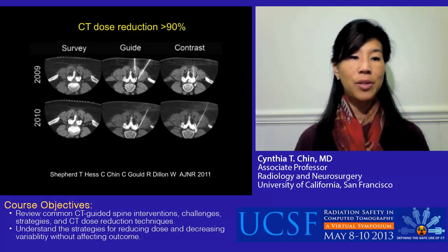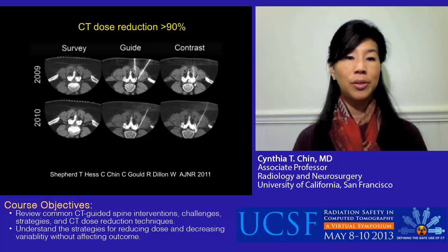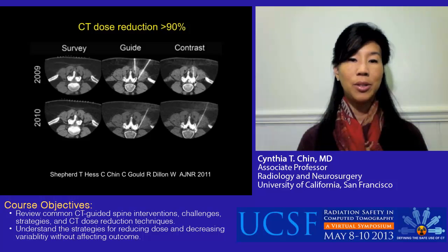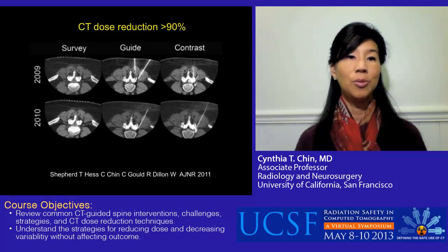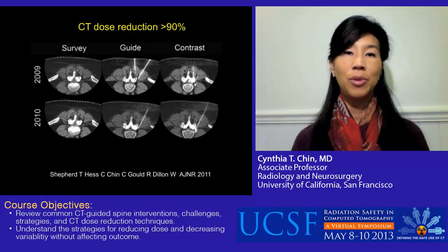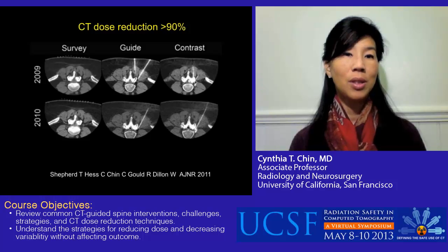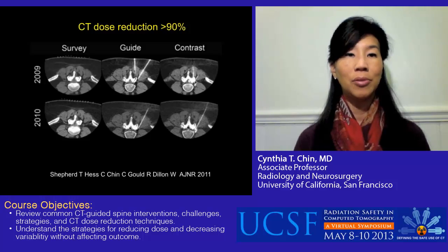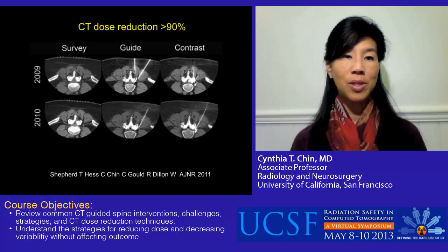And for the contrast view, from 199 MA to 50 MA. And this resulted in a total examination reduction in dose by 91%, without change in technical success and without change in patient outcome. This patient experienced the same degree of significant pain relief in 2010 as she did in 2009.